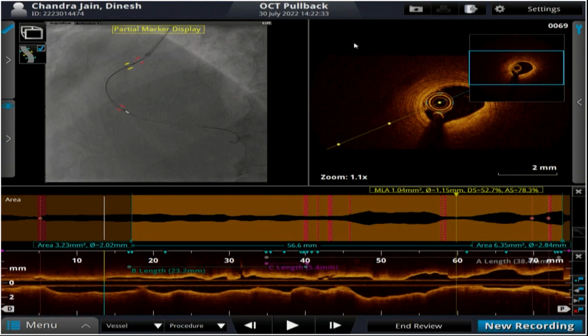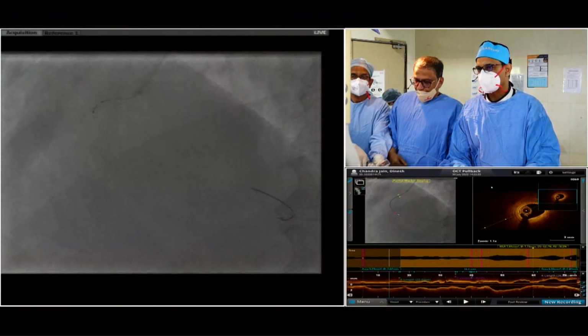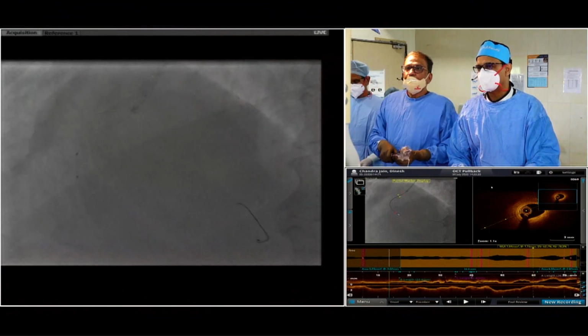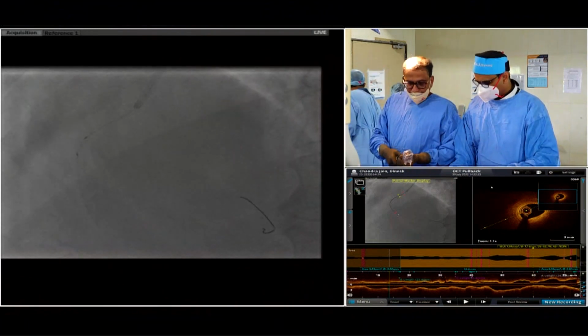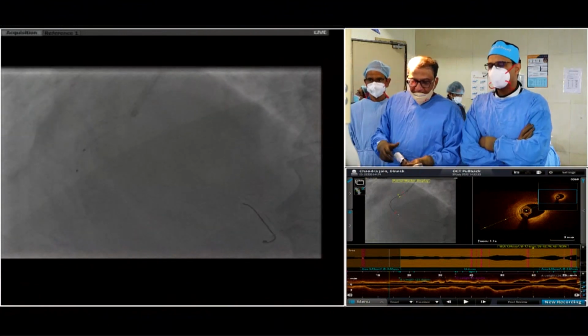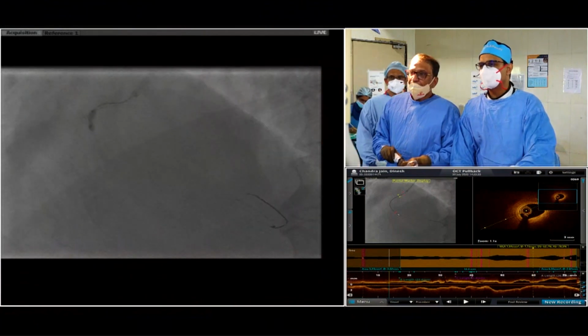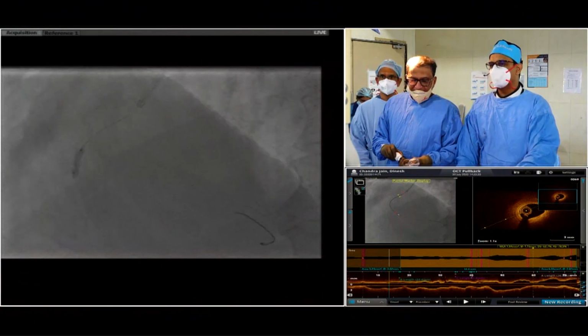So how much saline do you inject when you're injecting? Because you got very good images. I have a 50 ml syringe, and I use approximately 20 ml in each injection.